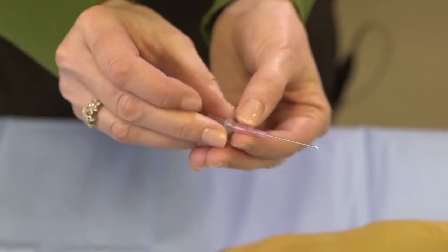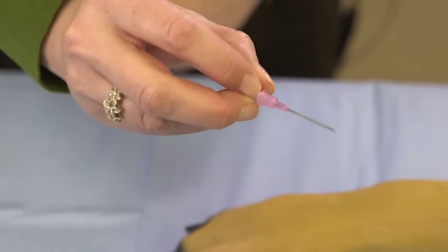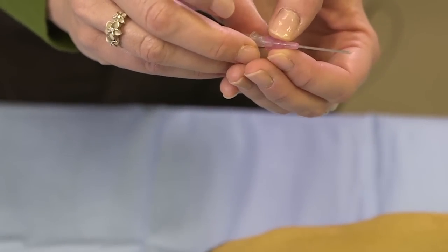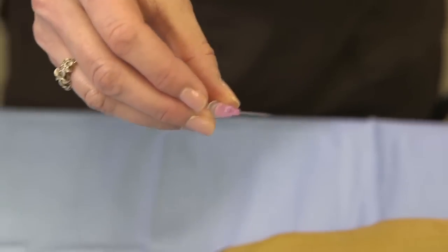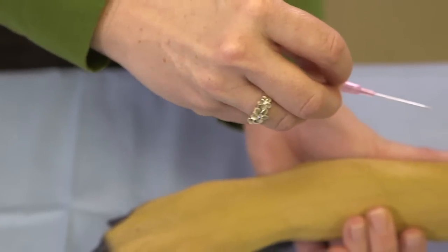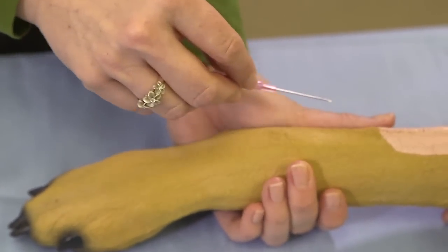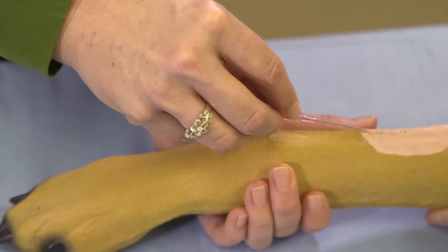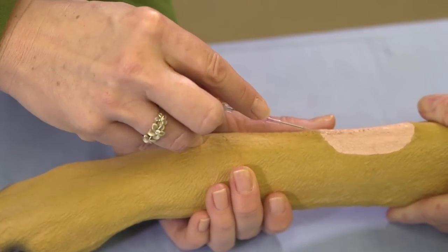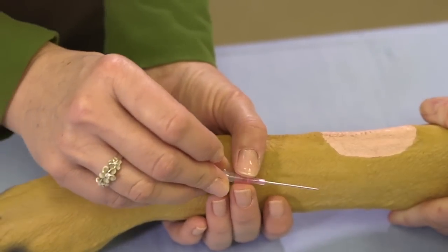Grab your stylet with your middle finger and your thumb. You want your first finger to be able to push that catheter off into the vein. When you are putting a catheter in and you go into a vein, you may want to actually pull back on the stylet, keeping your catheter in the same place, rather than pushing your catheter into the vein.